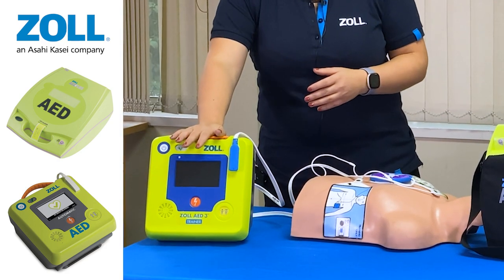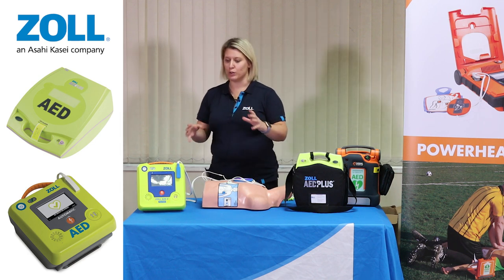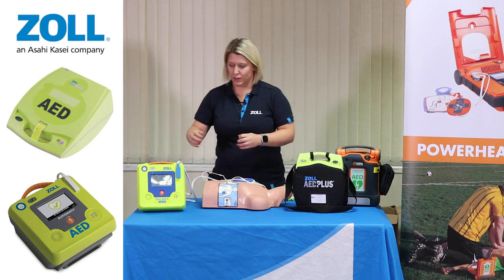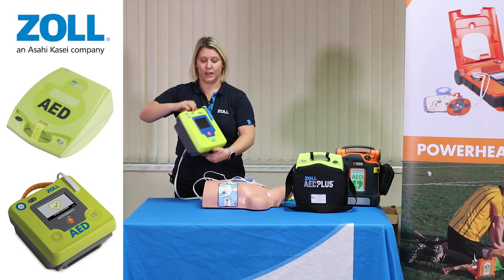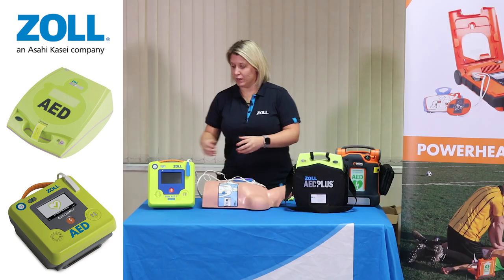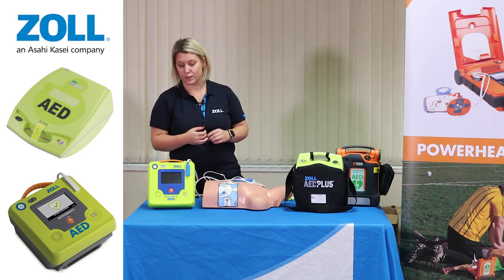In terms of the AED3 device, which is this device here, this is our most advanced device. It's been tried and tested with first responders and the fire service. We gained intel and clinical data to input as much technology into this device to increase chance of survival and also increase user friendliness. The actual unit is very lightweight. The pads are stored in the back of the device and on the front there is a paediatric capability button which lowers the joules required to administer a shock to a paediatric patient. There's also a rescue ready indicator, with the device conducting self-checks every week and every month to ensure usability in the instance of a sudden cardiac arrest.